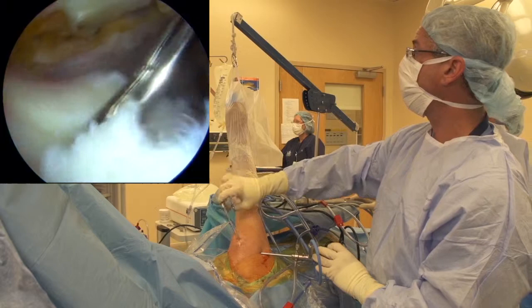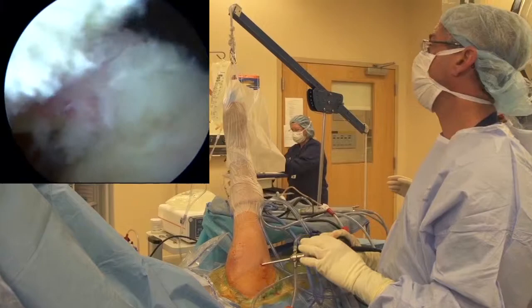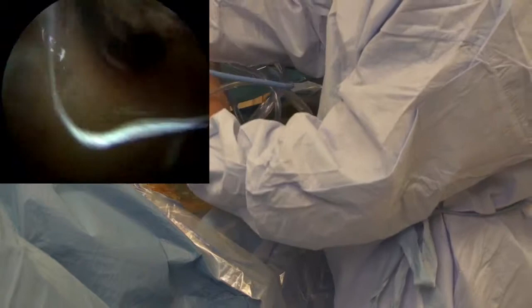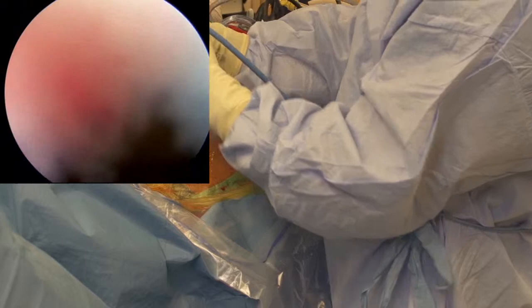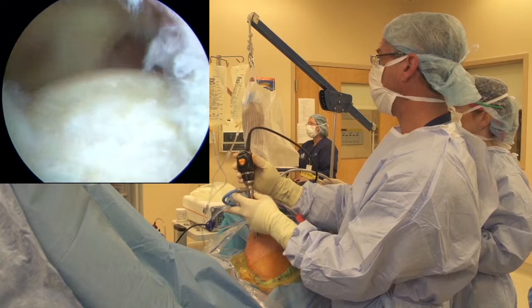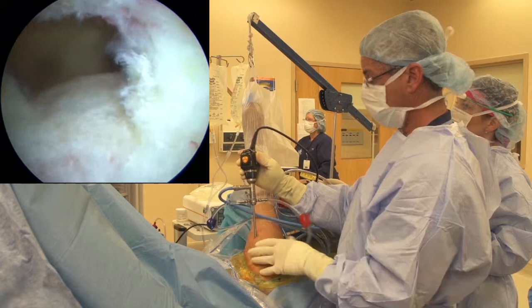Without a doubt, this is the type of crescent tear that we're going to bring over in a reasonable pattern. It may get a little bit of a dog ear, but I'm not too concerned about that biceps tendon underneath - tracking okay, we'll just be very careful not to grab that on the way in or out. We can also go ahead and visualize the tear pattern from the lateral position to verify that everything is going where you want it to go. Here's our tear pattern - we can see that's going to come over quite nicely. There's the articular cartilage margin, and with our nanofracture technique we can see a little bit of delamination between infraspinatus and supraspinatus.